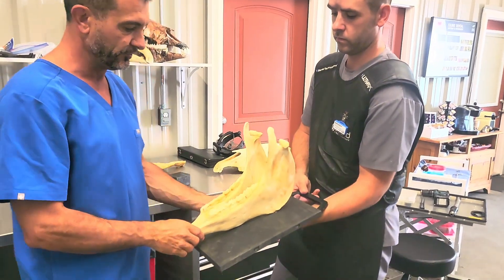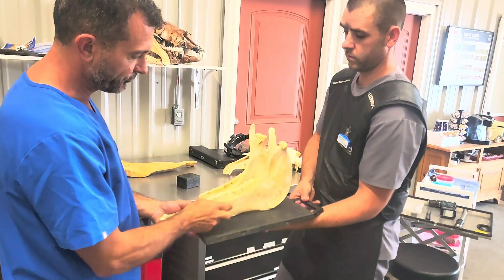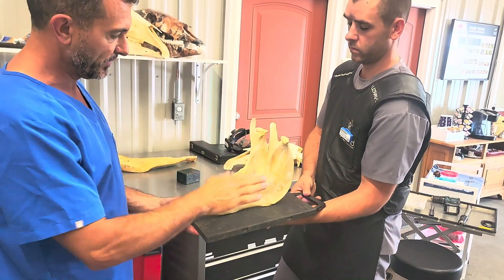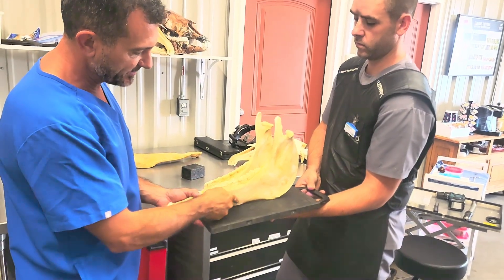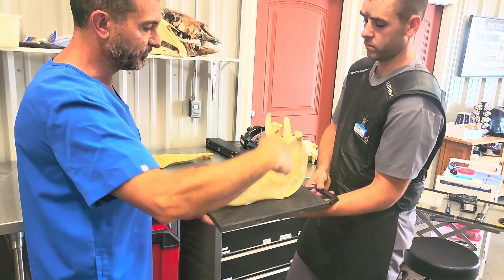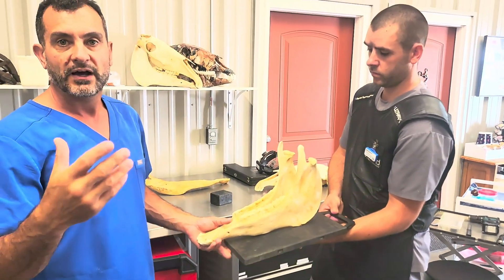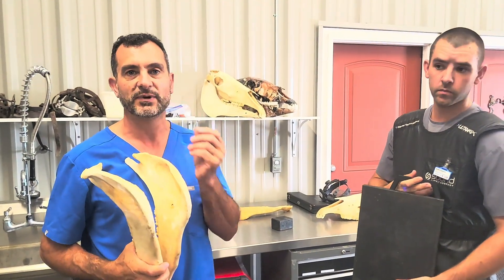There's another view that's really fantastic: put the plate underneath the jaw and then take the generator and shoot down. You're still trying to image the same tooth, but here you put the plate underneath and shoot down at about 45 degrees. That gives you a different view, and both views are helpful. We've got a horse here that's sedated with mandibular swelling and we're going to demonstrate these views on him.